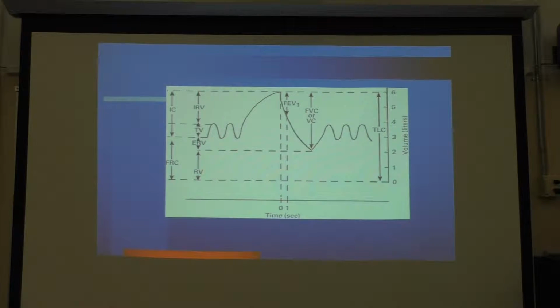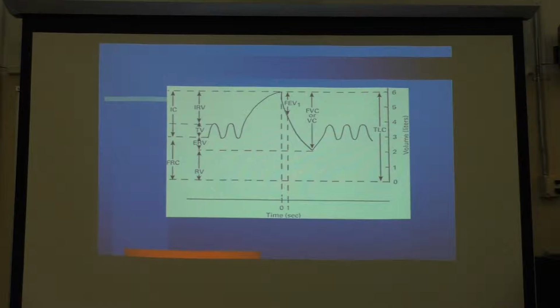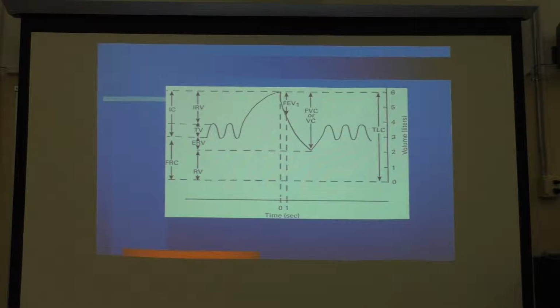And so they've expired their IRV, their tidal volume, and their ERV, which makes up their vital capacity, or in this case, forced vital capacity.